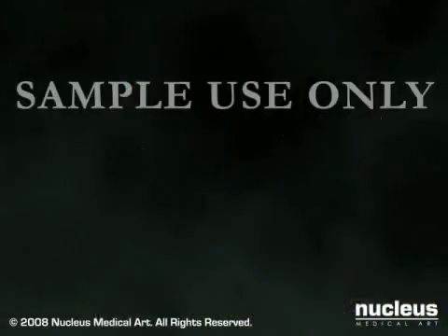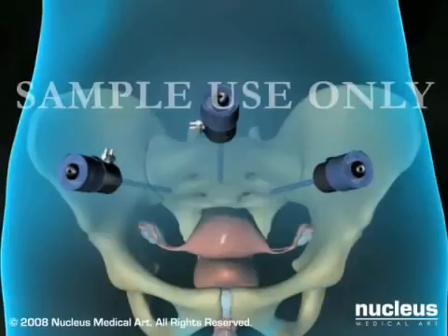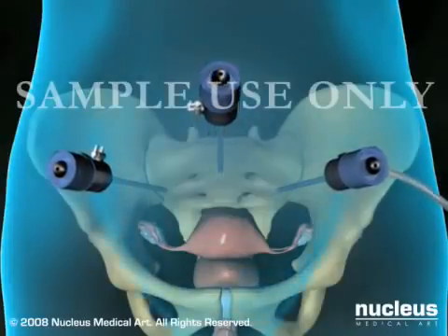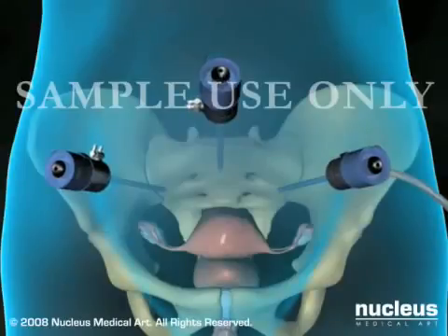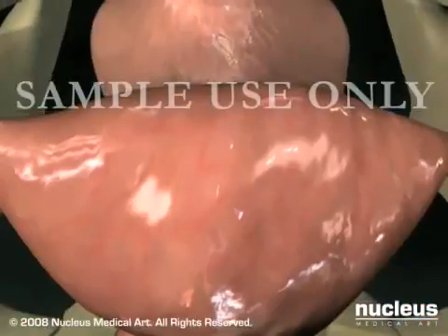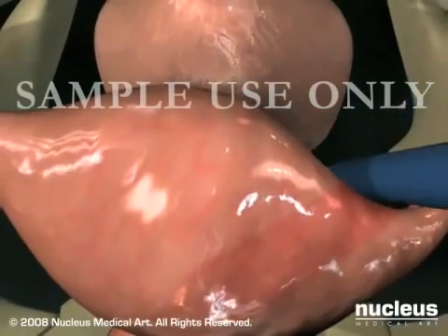For laparoscopic-assisted vaginal hysterectomy, your surgeon will create several small incisions called ports in your abdomen. Carbon dioxide gas is then pumped through one of the ports to puff up your abdomen so its contents can be viewed more easily. Your surgeon will then insert a laparoscope through one of the ports. Images from its camera are projected onto a video monitor in the operating room.